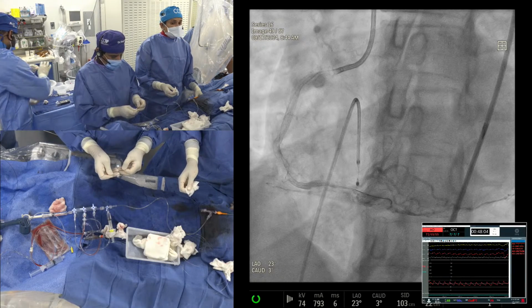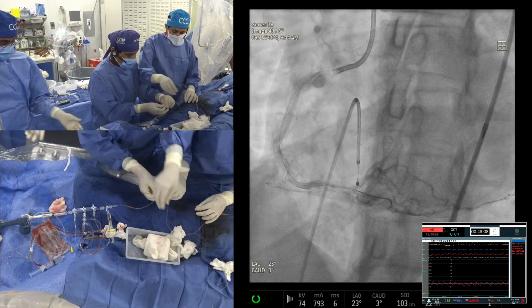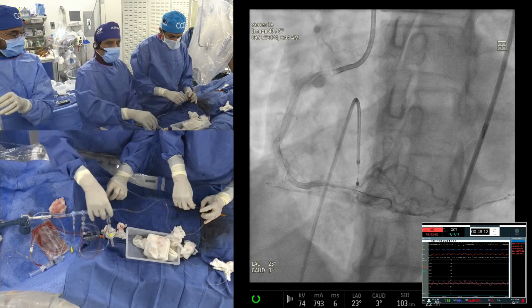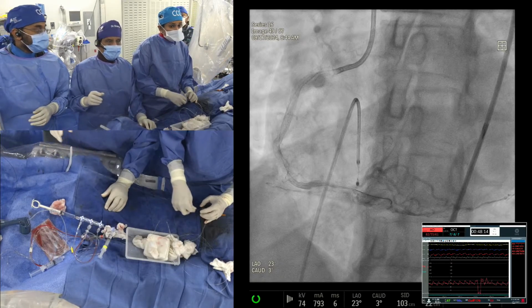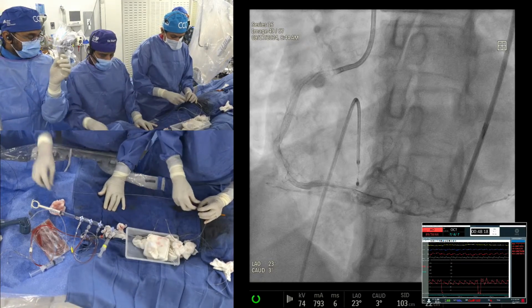So now, a question I always say, these guideliners and so, take them out when you don't need them, because they always will decrease the lumen and will decrease the flow. See that just by tracing is good, the STs are down because of establishing the flow.